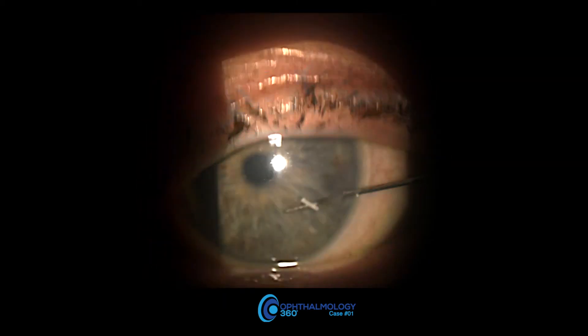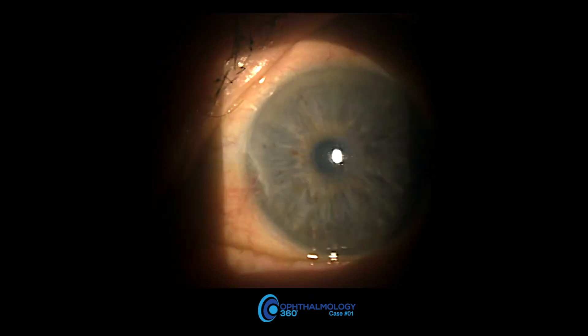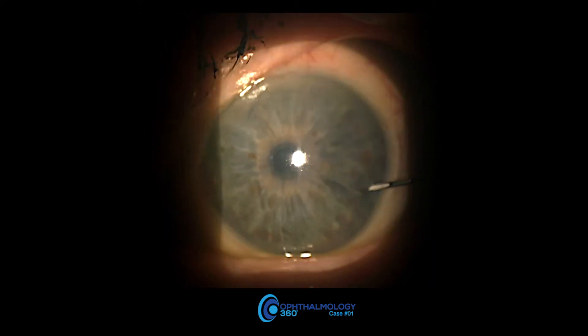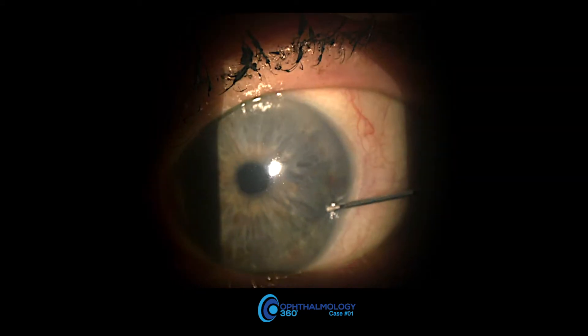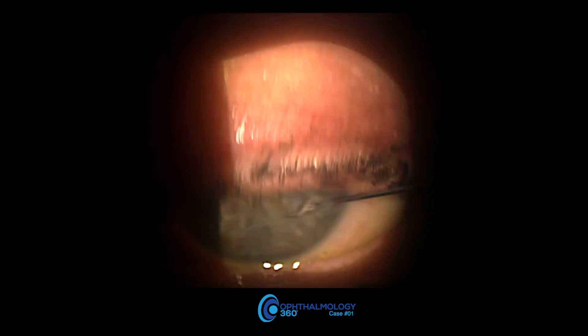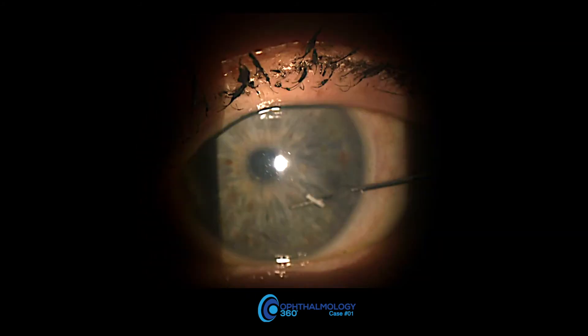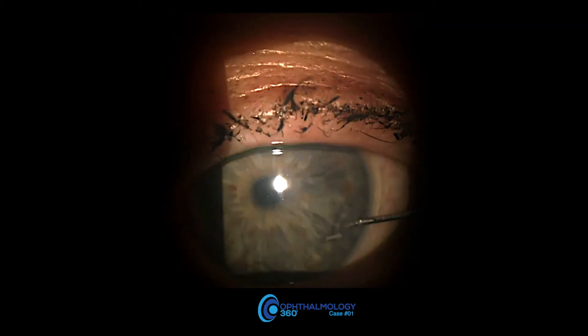Again, the bimatoprost implant adhered a little bit to the injector, and it's just a matter of rolling it around a little bit and just being patient, and it will come off. I have not had any adhere to the injection site. So as long as you're patient, you can leave that thing in there for a few seconds comfortably.